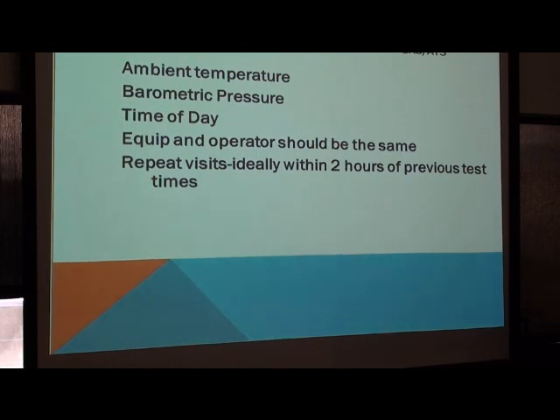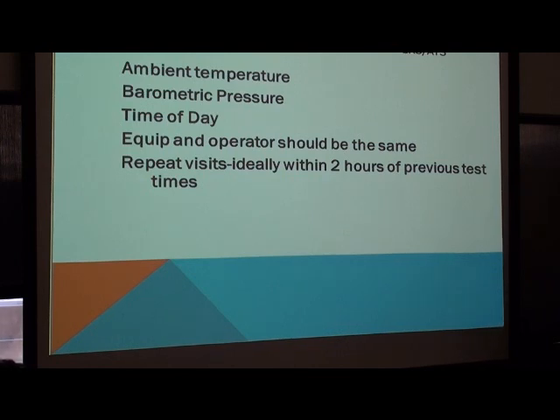The ATS-ERS does recommend that the time of day on repeat tests, serial tests, be comparable within a couple of hours of each other. That's not a scheduling consideration that's typically given, but there is some diurnal variation in lung function. This is one that we really don't worry about. Again, ATS-ERS recommendations, they probably feel obligated to cite everything that's been noted to affect lung function. It has been noted in some studies that equipment and operator differences do exist. And that's one of the things that, as I said before, we really try to minimize.